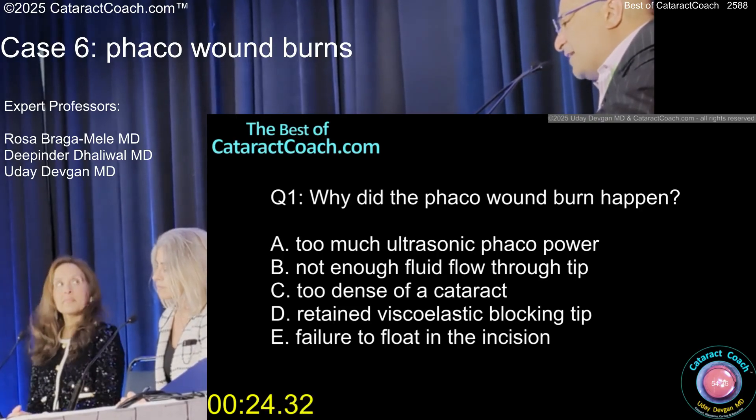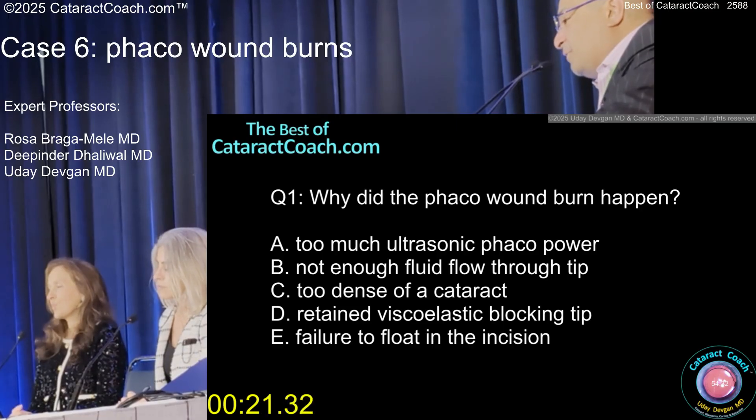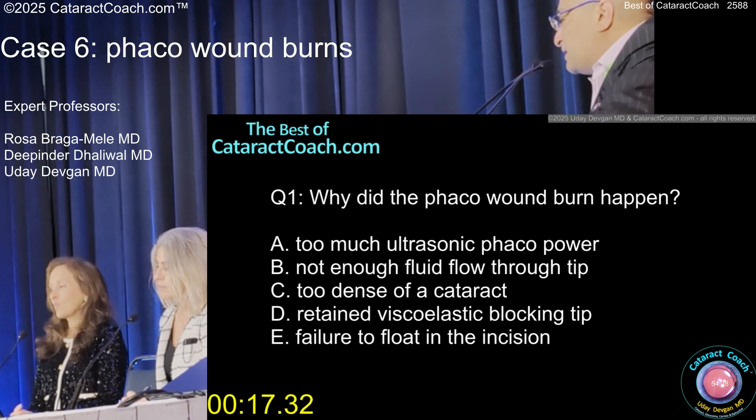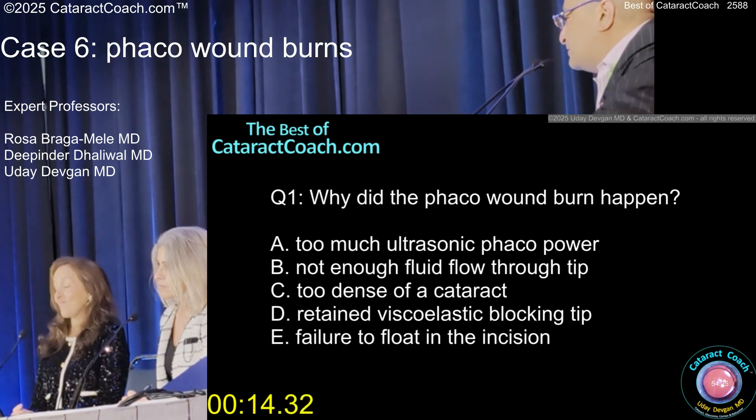It wasn't too dense of a cataract, and it's not really too much power — well, it's too much power for what you did, if you're pushing the needle up against the cornea. That cornea stroma is all protein — it cooks like an egg white.